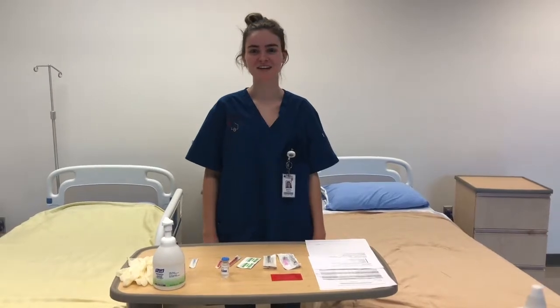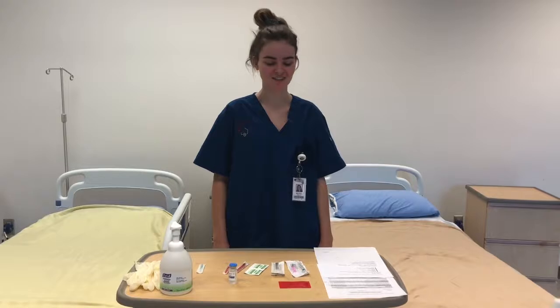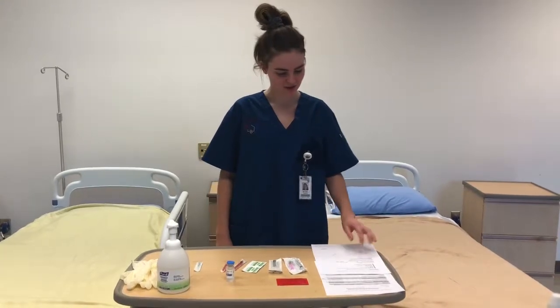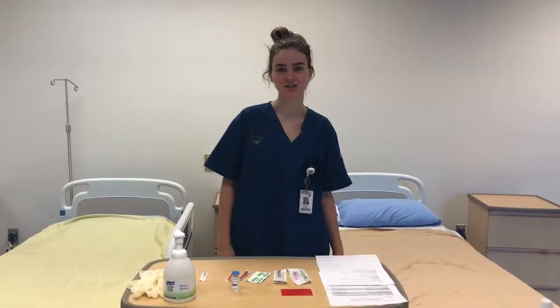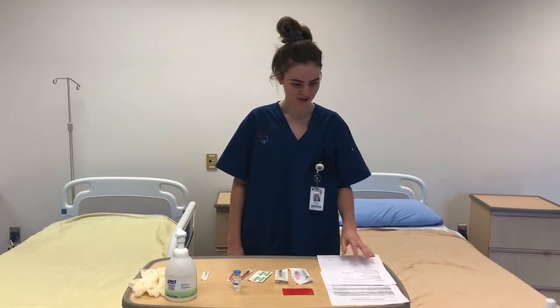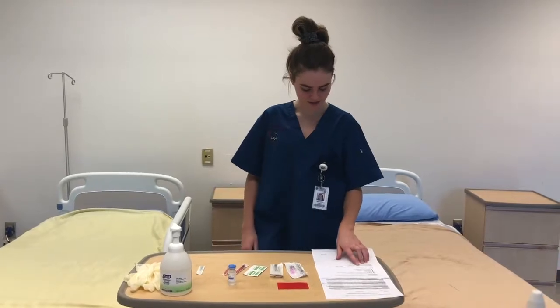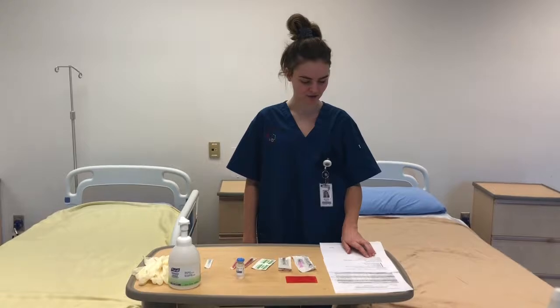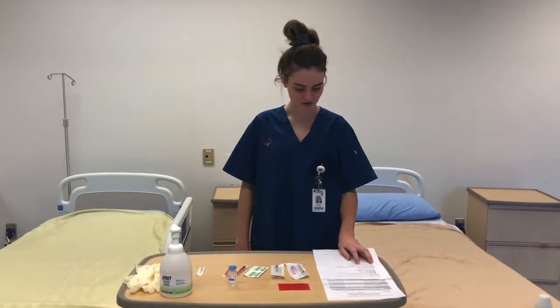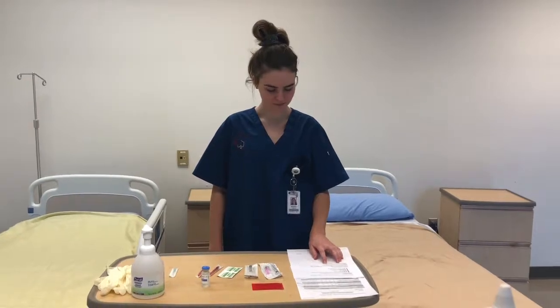Hi, my name is Alicia, and I am a level 2 Mohawk McMaster nursing student, and I'm here to give Mr. Mancini a sub-Q injection and an IM injection. While looking at the MAR, it says heparin 5,000 units subcutaneous every 12 hours, and the Haldol is 1 milligram IM every 4 hours PRN.